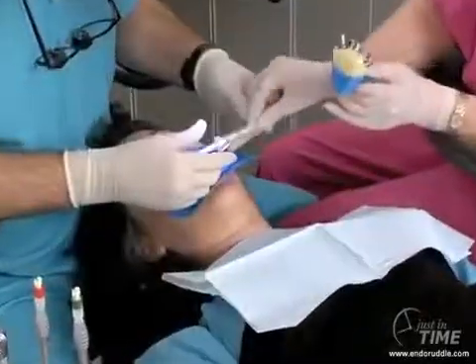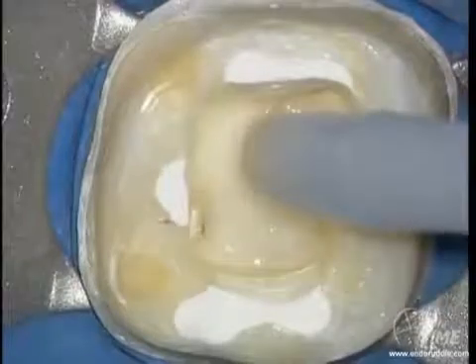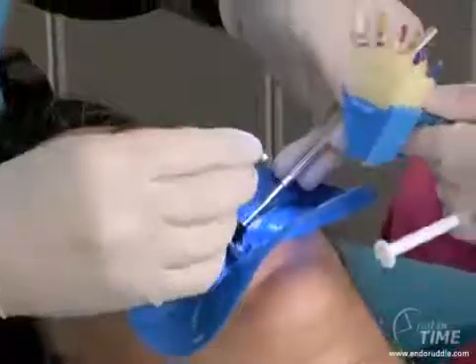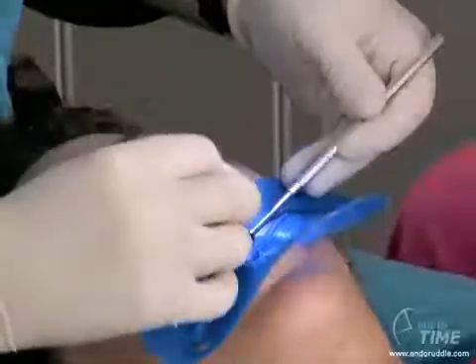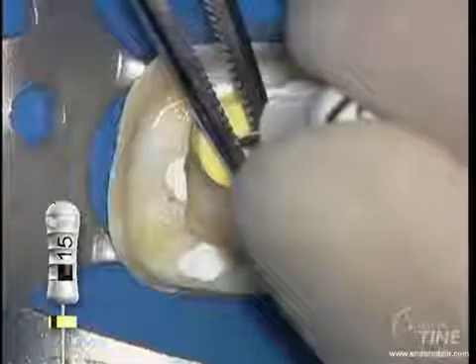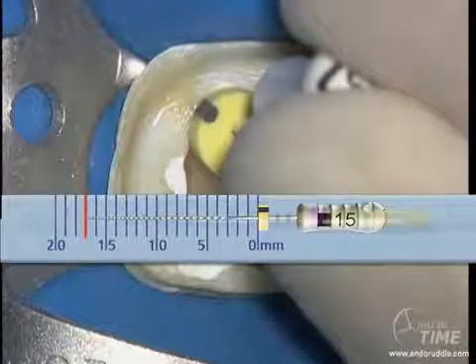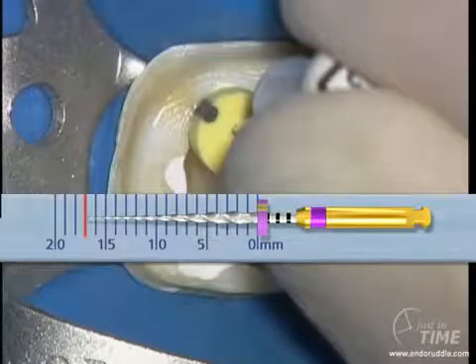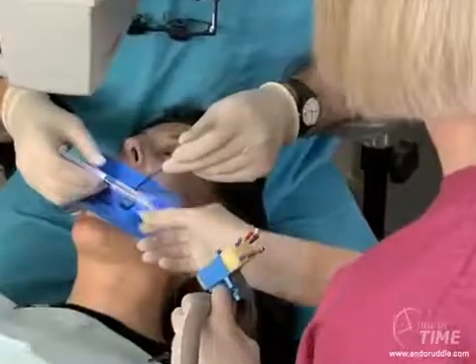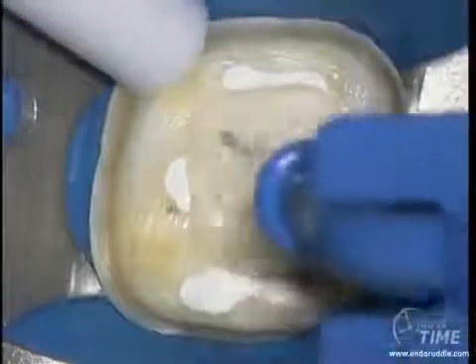Clinically, we like to work with assistants to benefit the economy of time. The viscous chelator can be handed over and dispensed into the pulp chamber. In the presence of a viscous chelator, we begin to immediately secure the canal — first with the 10, followed by the 15 hand file — working about two-thirds of the overall canal length. The rubber stop is pushed down on the reference point, the instrument is withdrawn, and that length is transferred to the first rotary shaping file. We always secure canals in a viscous chelator, but we always shape canals in the presence of an aqueous solution such as sodium hypochlorite.